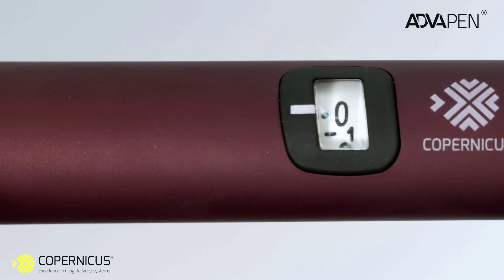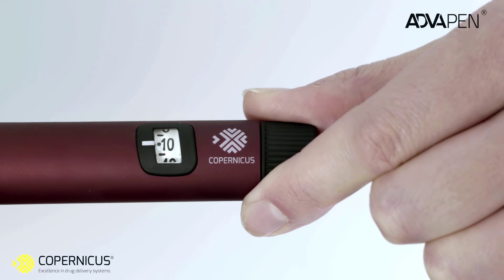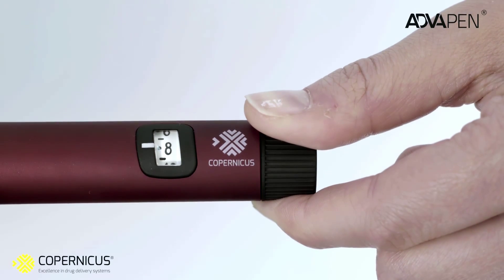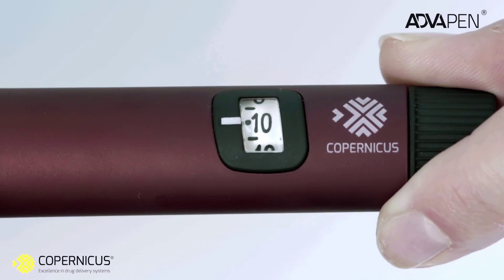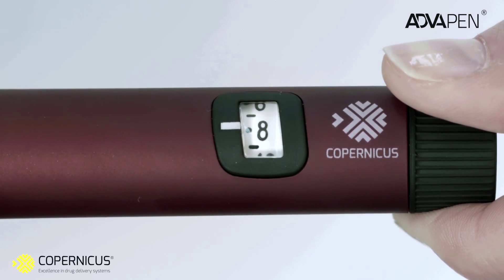To select the amount of insulin you want to inject, turn the dose selector clockwise until you see the desired figure, which corresponds to the number of insulin units you want to inject. If you have chosen a dose that is too high, you can easily reduce it — rotate the dose selector counterclockwise until the desired dose appears in the dose selector window.